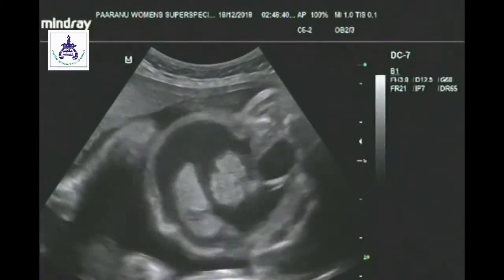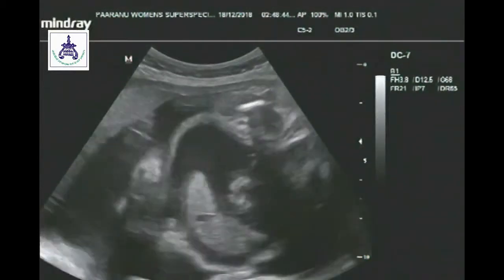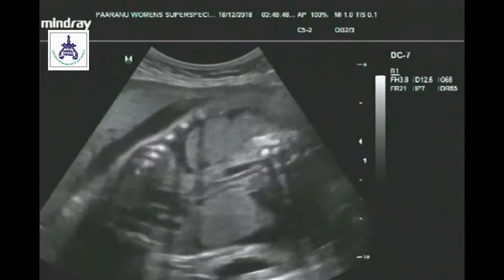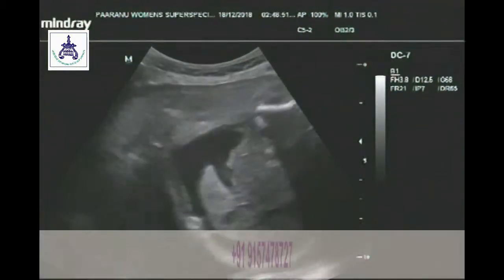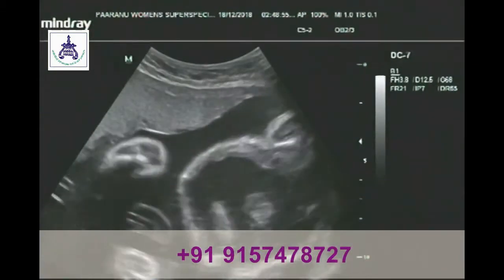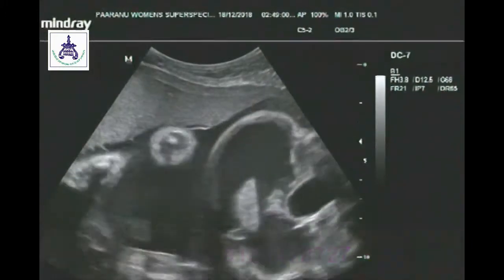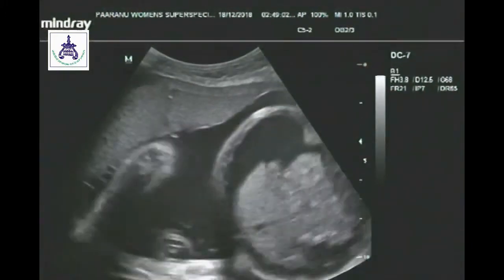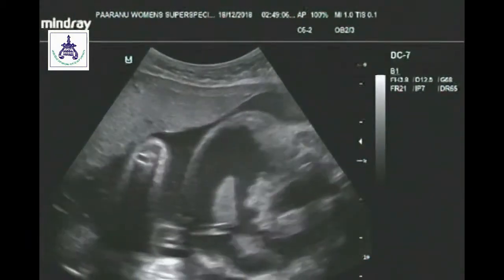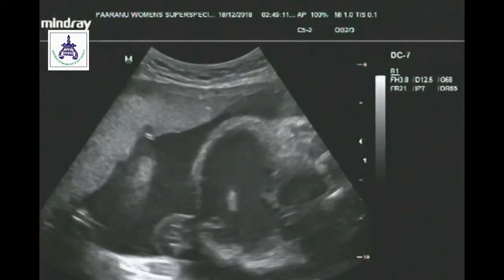In this image, we can see the fetal ascites. The liver, small intestine and other viscera are floating around in the fetal abdomen, and there is around 100 to 150 ml of fluid collected inside the fetal abdomen. You can clearly see the urinary bladder and the surrounding small intestine and other viscera. Now we are going to put the needle inside the abdomen.